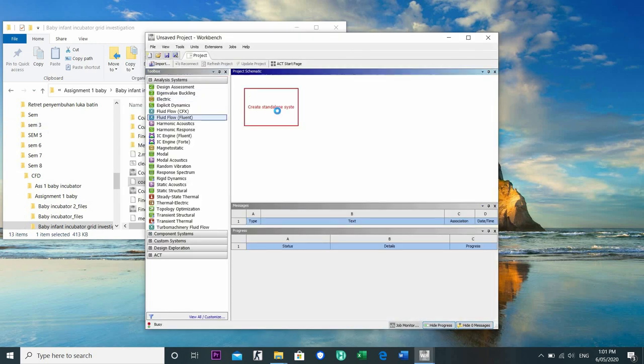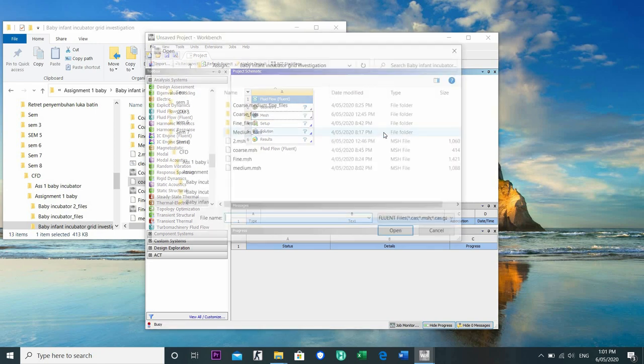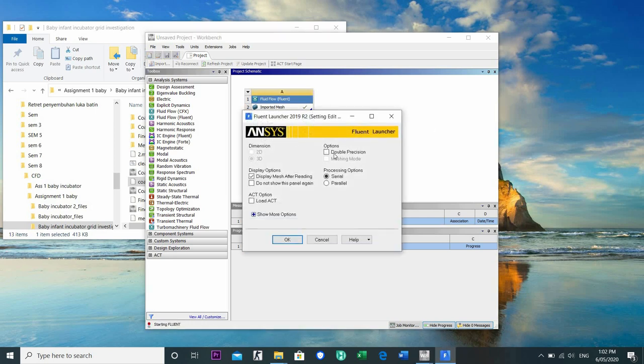Okay, we can see here, and we can right click here, import mesh, and then browse. We have input the second mesh, and then we can use the second mesh or the coarse mesh. It's all the same. Okay, as we can see here, it's already green. If it's not green, you can right click like this and then update. Okay, as we can see, there is double precision.